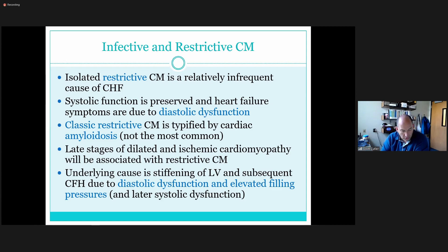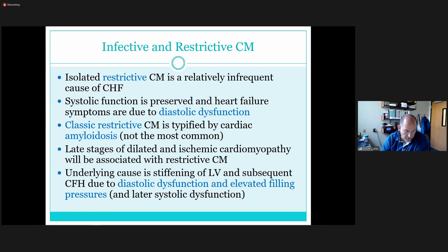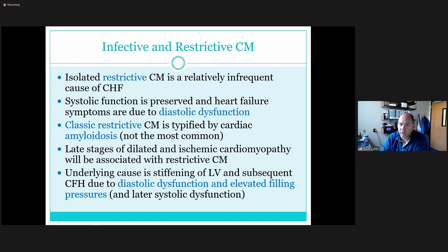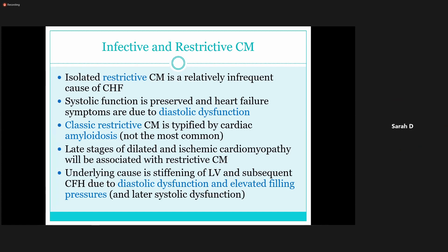The typical presentation is in amyloidosis — we'll show some pictures here in a second. It's an infiltrative type of state with a restrictive appearance. There are other things that can mimic it. In later stages of ischemic cardiomyopathy you can also see it. The take-home on restrictive from a 2D perspective: ventricular chamber size is normal, but we have bilateral atrial enlargement — that's an important point to distinguish it from constrictive cardiomyopathy, which we haven't talked about yet. They are two totally different things.